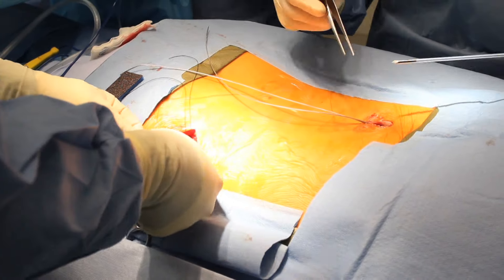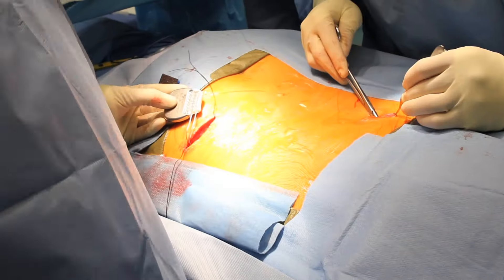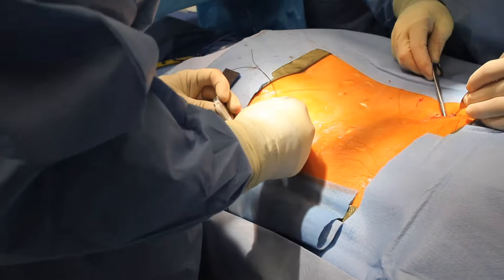In this surgery, we cut down to the muscle, but we do not cut muscle, and there is nothing cut other than skin and fatty tissue.